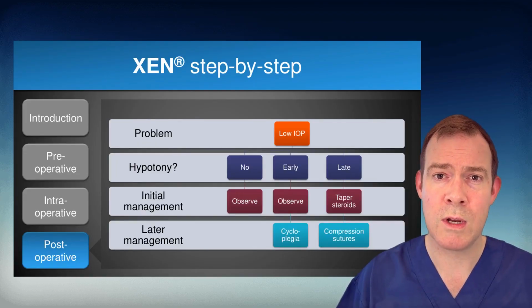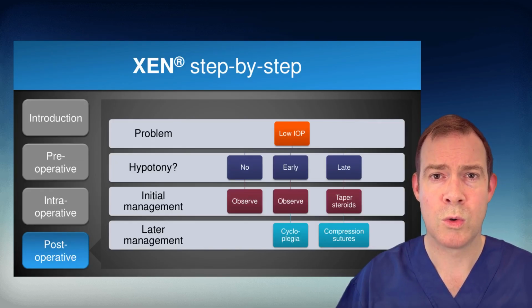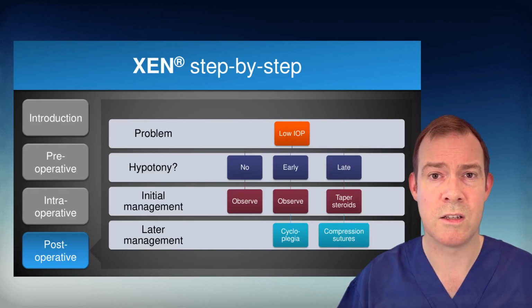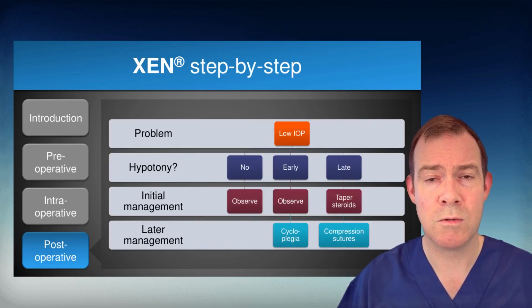We're now going to look at 3 scenarios after XEN: low pressure, high pressure, or XEN-related complications. Low pressure is commonly seen, and is seldom a problem. Usually there's no clinical signs of hypotony, the anterior chamber is deep, there's no choroidal effusions, and this can simply be watched. There may sometimes be some signs of hypotony, such as a shallow anterior chamber or peripheral choroidal effusions. Again, in most instances, these can simply be observed, or sometimes a topical cycloplegic can be started.